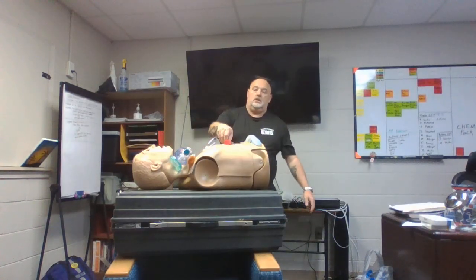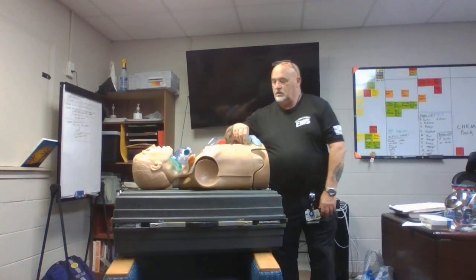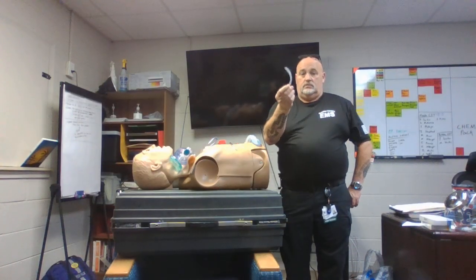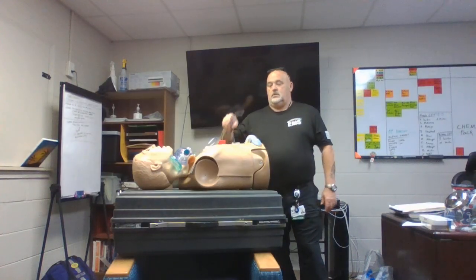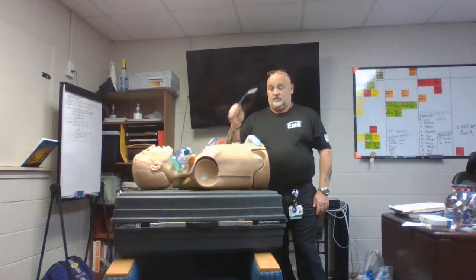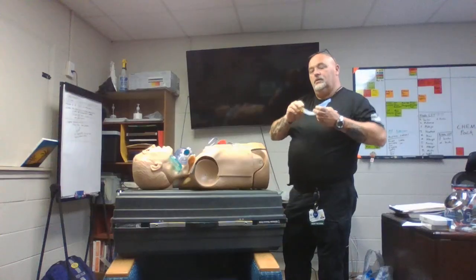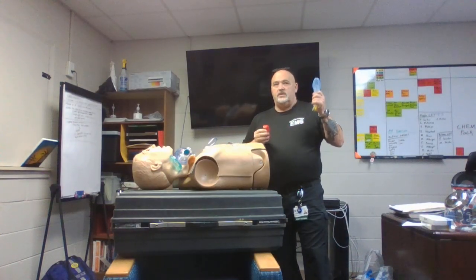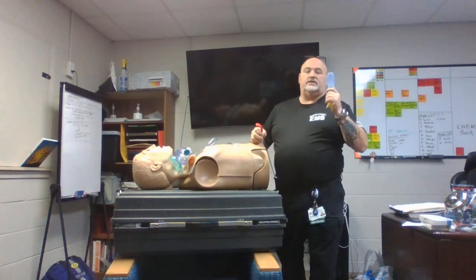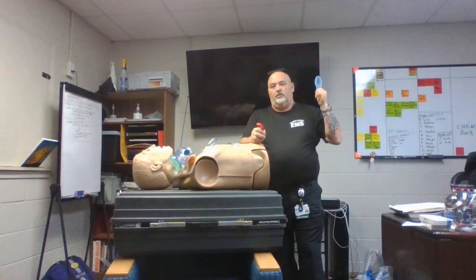So that being said, we've covered what? Measurement and placement, indications and contraindications. Our friend is called a suction, correct? And the BIAD. We haven't really covered them much, but we will. Basically the same indications, right? Do they have an intact gag? Yeah, this is out. Caustic ingestion, this is out, right? We don't want to use them.